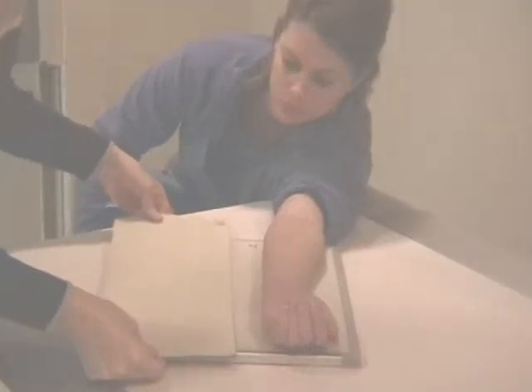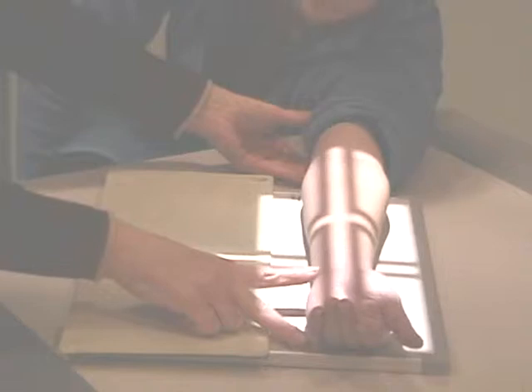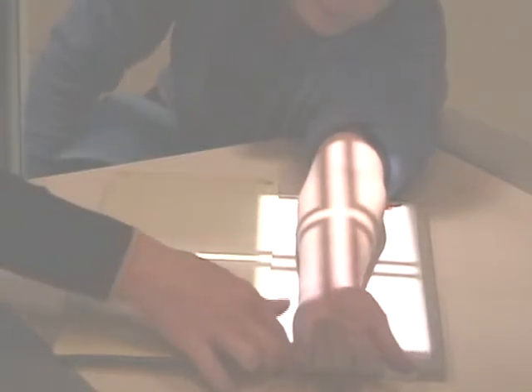I'm getting everything lined up here, adjusting the collimation. I've divided the cassette in half. There are marks on the cassette, and you divide it in half. Remember, before I analyzed her arm shape, I'm actually positioning it now, and I want her carpal bones about 1.5 inches from the film's edge. Can you lean in just a little more? There we go. Good. And the elbow joint will clear the ID blocker, and the carpal bones are 1 inch from the film's edge.